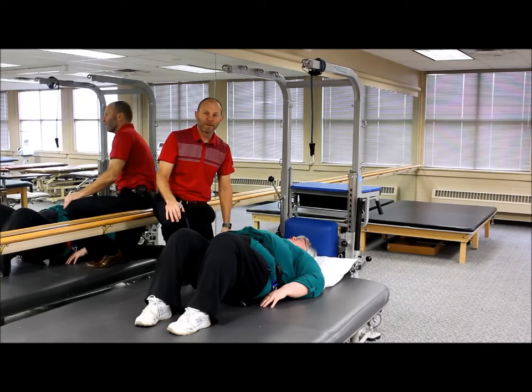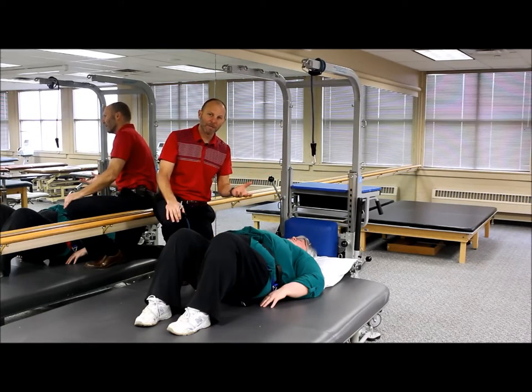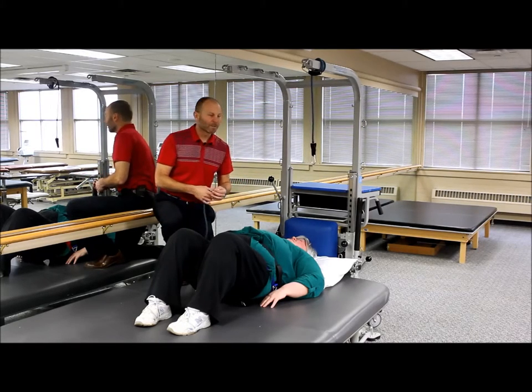The rehab station can be used for numerous other functional activities. One of the things we're going to show here is called an assisted bridge. If you're having a patient with difficulty doing a basic bridge maneuver, this is a way you can set them up to help them and also help yourself, so they can work on multiple repetitions with less physical assistance from you.